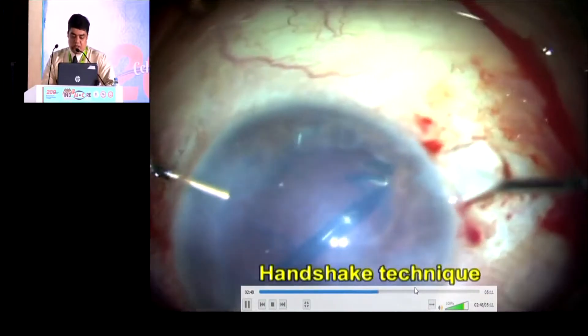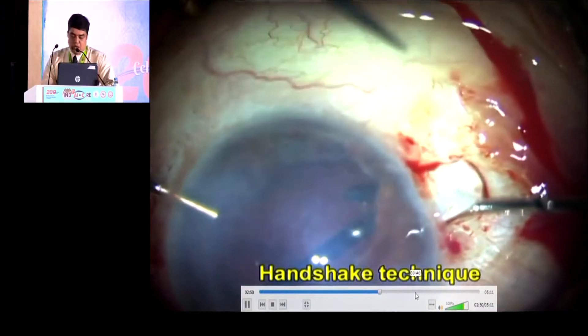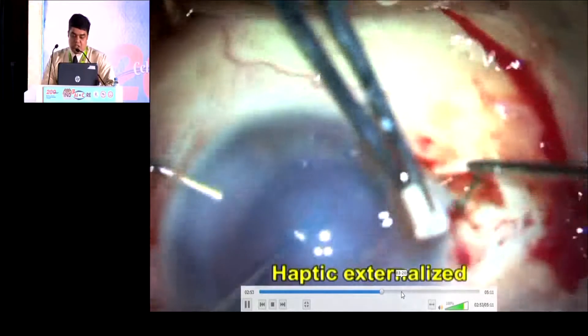Trying to bring the trailing haptic out and see to that it is through Scharioth's pocket, inserted through that.